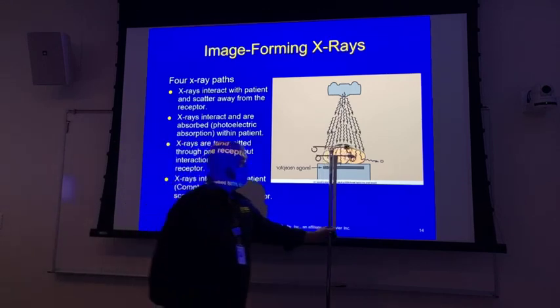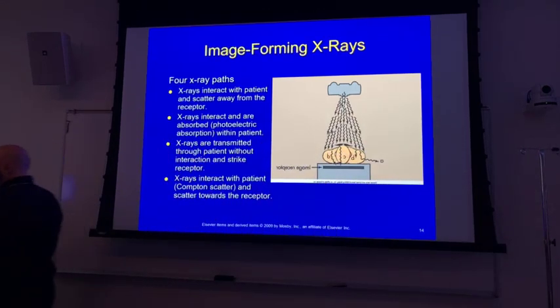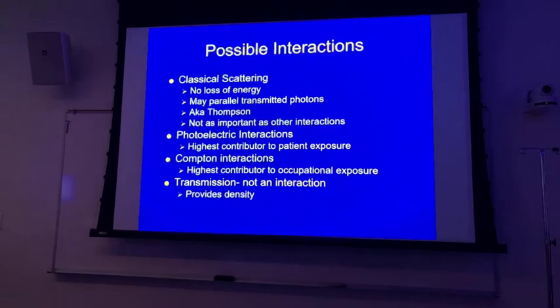Okay? So, make sure you follow your time, distance, shielding and get away from Compton when you can. So, written version of everything that we just talked about.